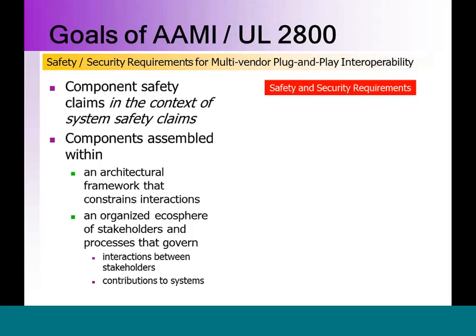So it's extremely important from the outset to realize that the theme of this standard is you cannot just come in and say we have a system that we want to take through a component-wise verification process, because the architecture of the system is key to making the whole thing work correctly and to provide the basic foundations for safety. So, for example, without the partitioning requirements that I talked about before, without the partitioning capabilities of the network, without the ability to declare your QoS properties and have those enforced by the system, you would not be able to approach confidently a framework that would allow you to do component-based development.